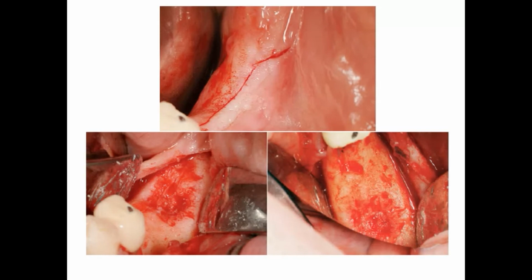A periosteal elevator is used to make a full thickness soft tissue reflection and expose the crestal bone and a few millimeters of the lateral aspects of the implant site. The buccolingual dimension of bone is measured and confirmed to be greater than 7 millimeters in width. If the site is less than 7 millimeters wide, a division B membrane and layered approach bone graft are used to augment the site, either in conjunction with implant insertion or as a separate surgical procedure before placing the implant.